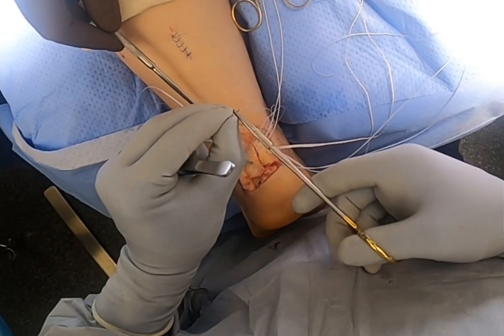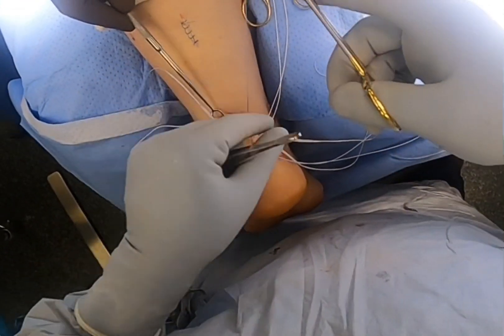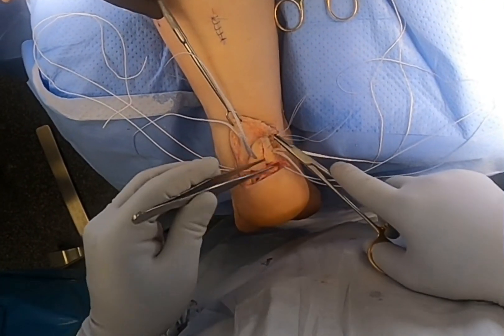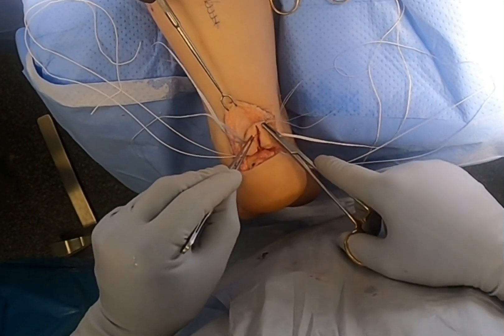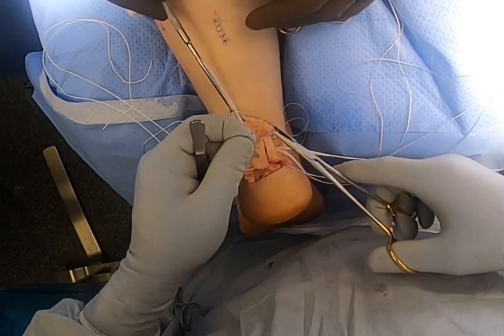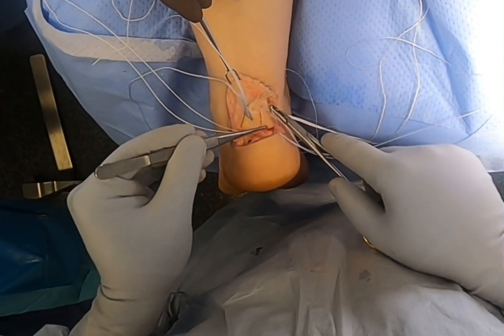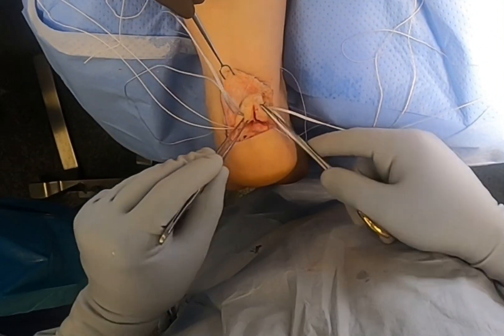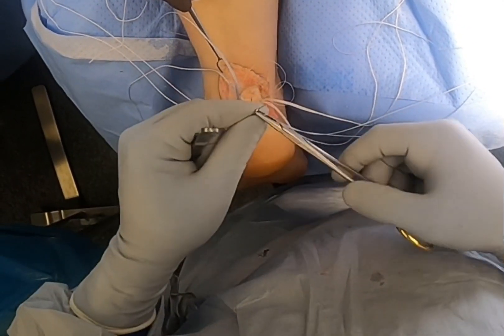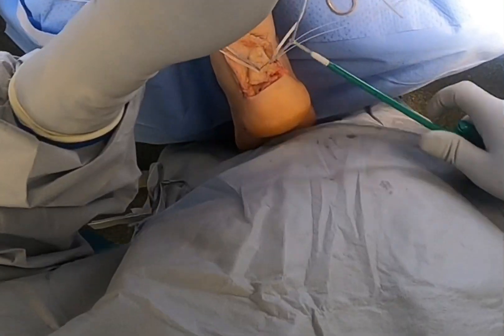Once that is performed, I then take an absorbable suture and re-approximate the central incision of the Achilles tendon, as this keeps this area even. If this is not done with this type of incision in the tendon, when you anchor down the tendon there is overlapping in this area, causing a bulging in the back of the heel — and patients do not like that. So I re-approximate the midline incision of the Achilles tendon before I put in the inferior anchors.